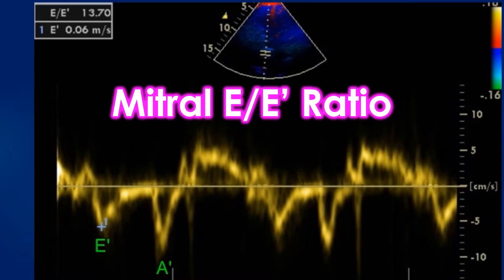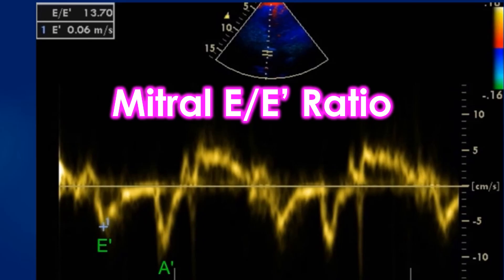Initially, Mitral E wave is measured and stored as given in the image below. After that, Colored Tissue Doppler, also known as Tissue Velocity Imaging or TVI mode, is switched on to assess Tissue Doppler. The cursor is placed over the medial mitral annulus and Tissue Doppler tracing obtained. E' velocity is measured and stored. The software usually gives the E by E' ratio.